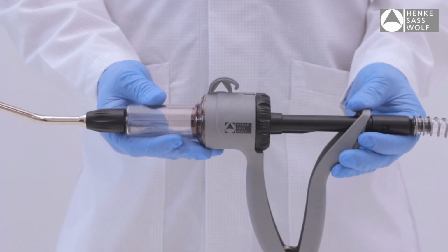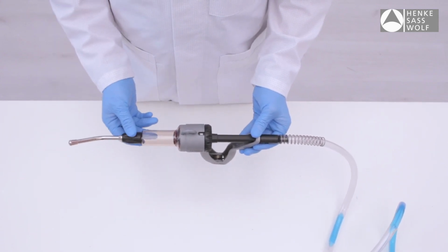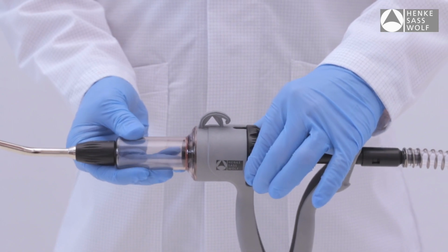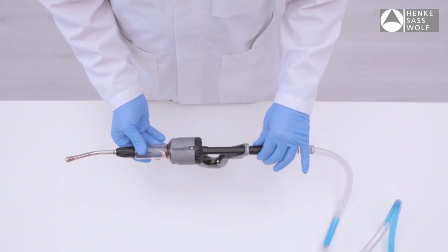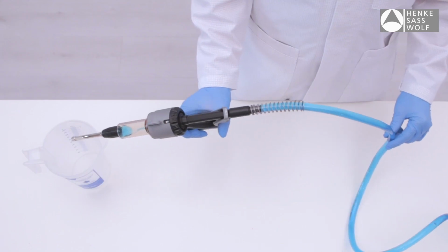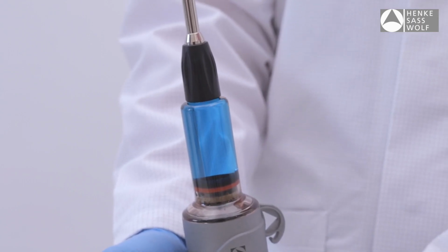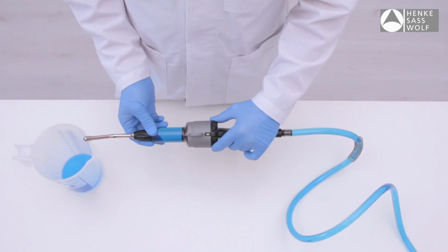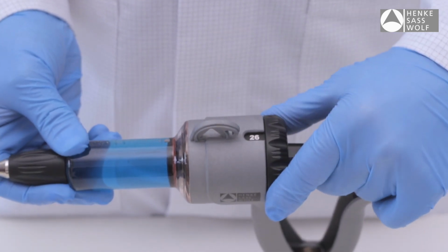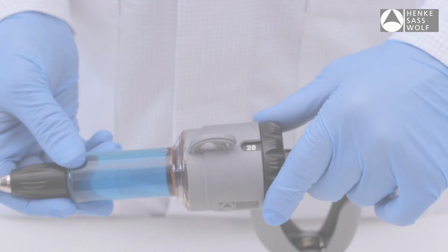Adjust the drench gun to the maximum dosage with the nozzle pointed upward at a 45-degree angle. Depress and release the handle repeatedly to draw solution into the plastic barrel. If there are air bubbles, repeat the procedure until there are no more. Please pay attention to the fact that the drench gun is completely filled and there are no air bubbles in the plastic barrel. The device is now primed and can be adjusted to any dosage as necessary. Turn the dosing wheel clockwise or counterclockwise until the desired dose is indicated in the window.